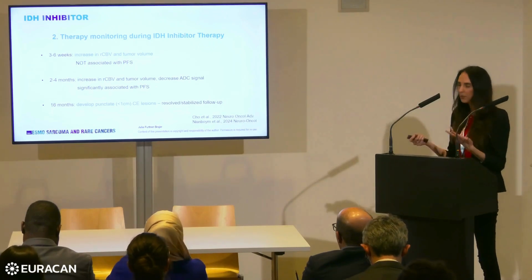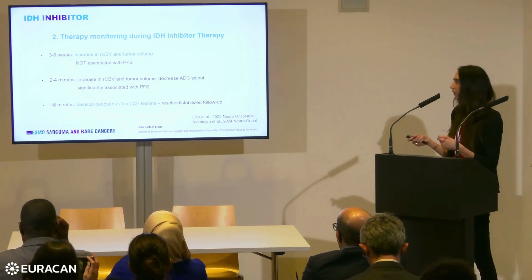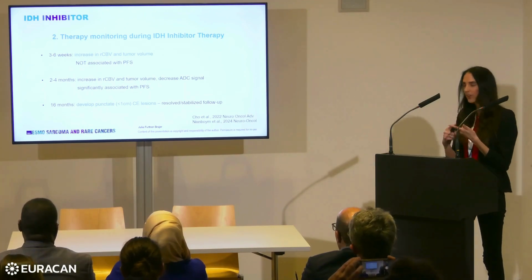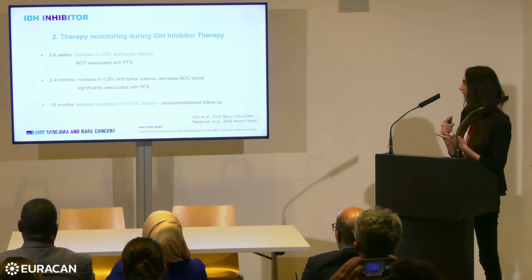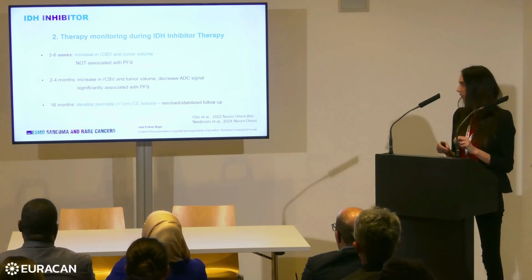Do another examination about 2 to 4 months after therapy initiation, because there are findings such as tumor volume increase, increase in perfusion, or decrease in ADC signal that were significantly associated with progression-free survival.